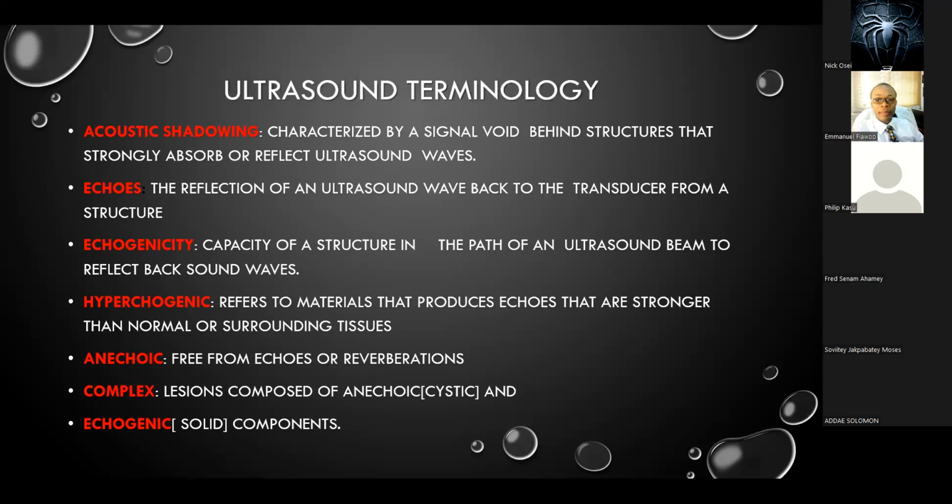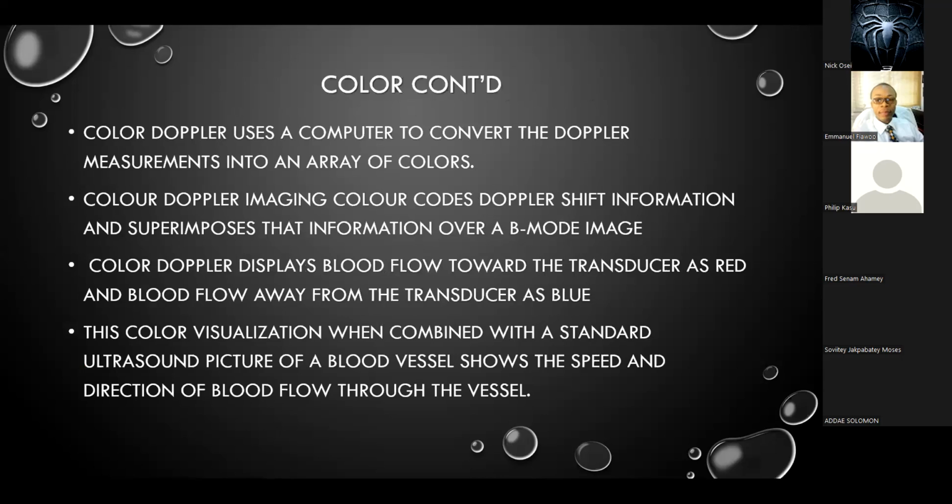As I said, some of them can be reflected, some can be deflected, and so on. When they hit a structure, and that structure greatly absorbs or reflects all the sound, then behind that solid structure or organ there will be no echoes coming from that side. I have a few pictures that we'll look at to get the picture. I think the second term should have come before this one. Let me do it to make it easier to understand.